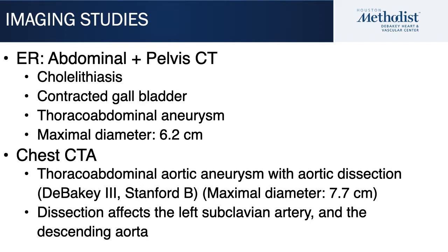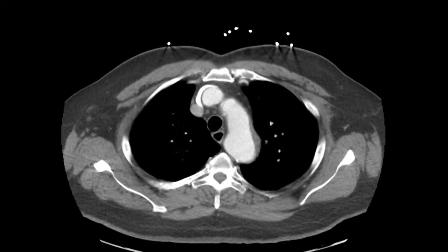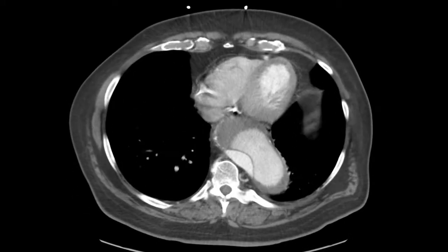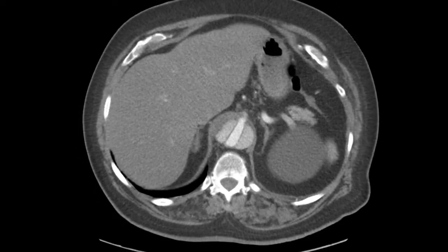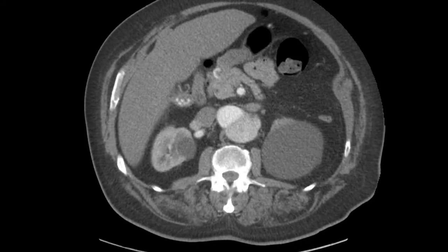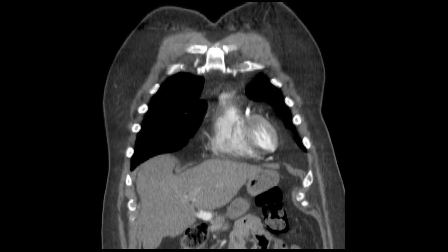On the CT, there was a dissection extending from the mid-descending thoracic aorta distally. He also had dissection affecting the left subclavian artery and the remainder of the descending thoracic aorta. The largest segment is in the descending thoracic aorta, tapering down at the diaphragm with significant compression of the true lumen. The right renal artery comes off the true lumen; the left renal artery, although opacified, is barely visible.